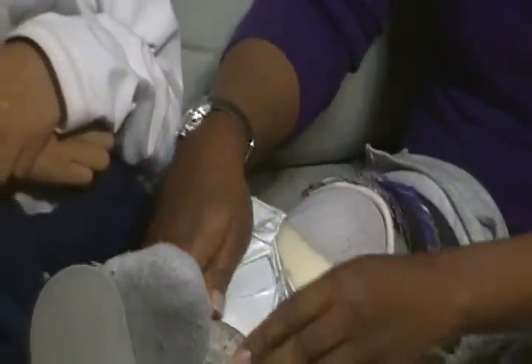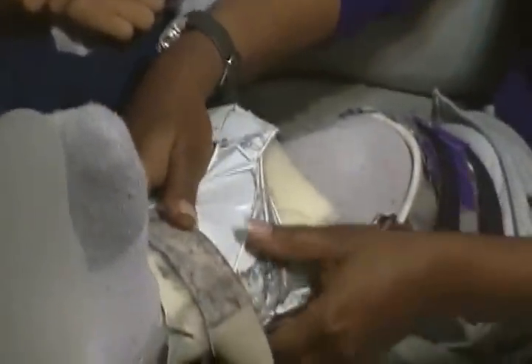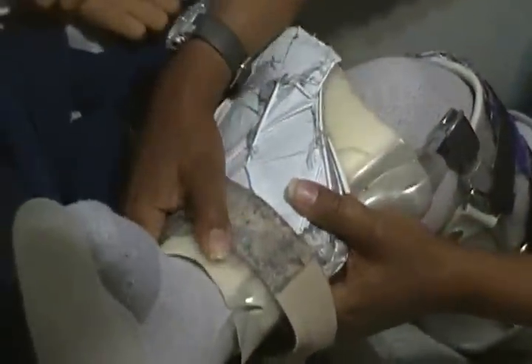Strap it back together. Make sure the lower half is as tight and secure as possible, because if it comes loose you're going to have an accident.